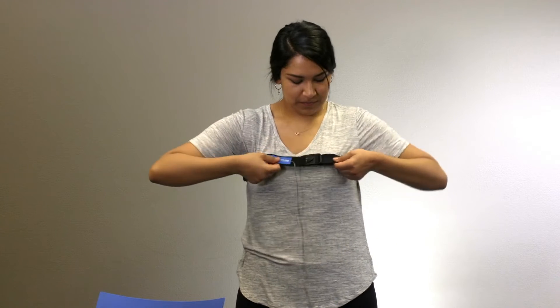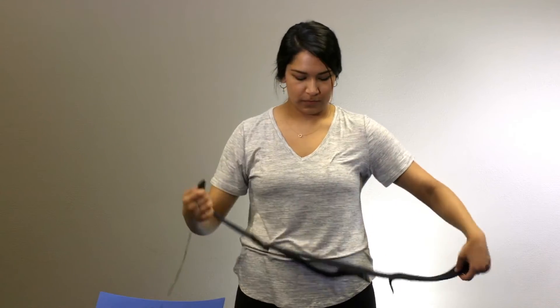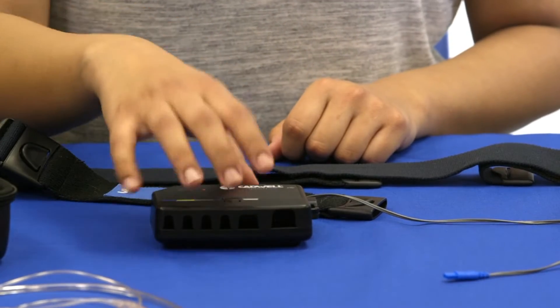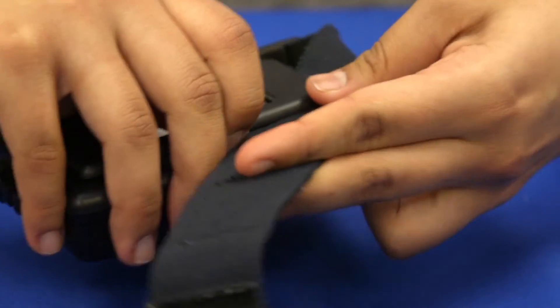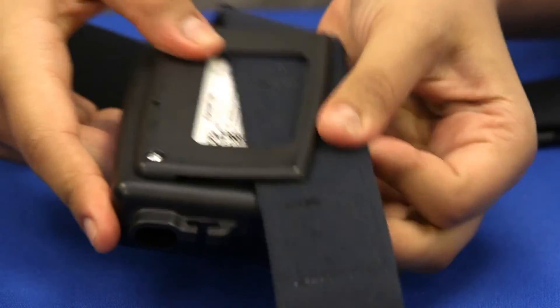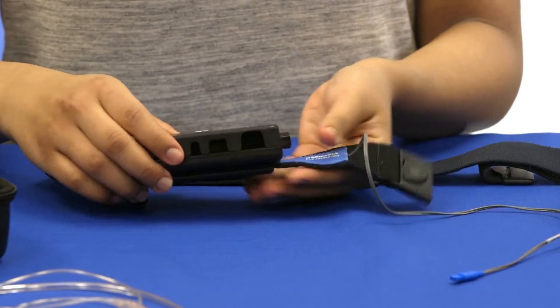Remove the belt to finish the setup. Orient the text on the belt and the text on the apnea track facing up, and connect the apnea track to the chest belt near the buckle by sliding the belt up under the clip on the back of the apnea track.